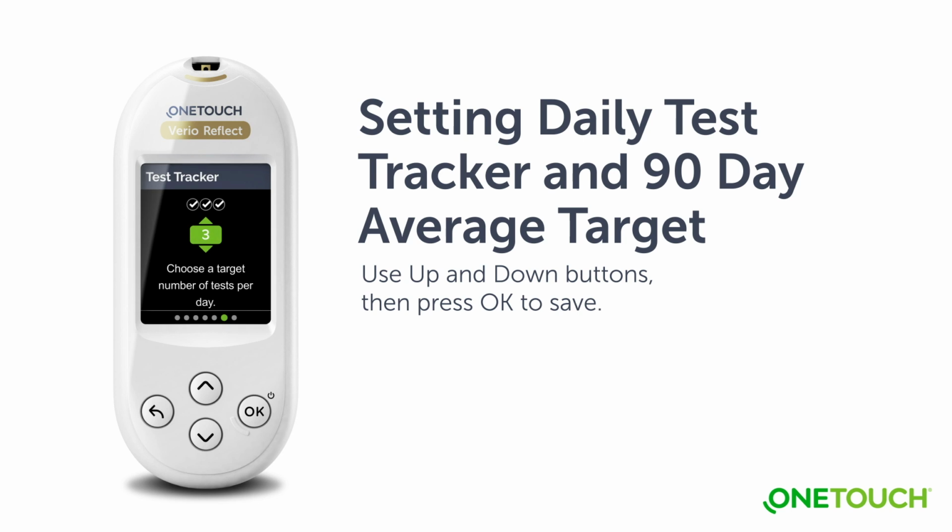The test tracker lets you set the number of glucose tests you plan to take each day and automatically tracks progress towards achieving that goal. The meter is preset with a daily test goal of 4 tests per day. The maximum daily test goal is 8.